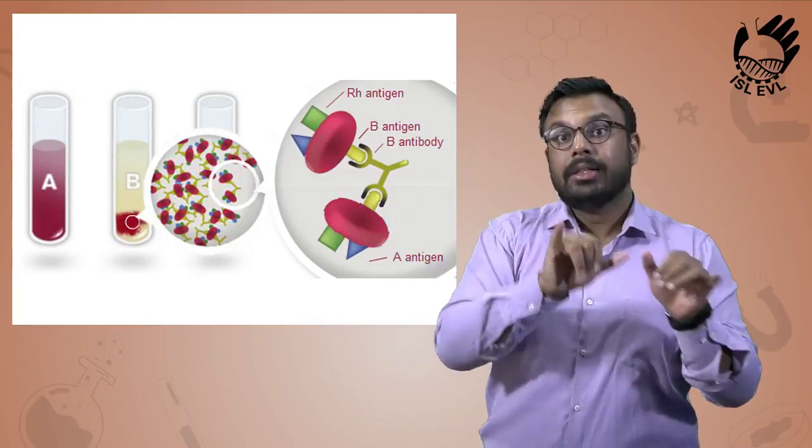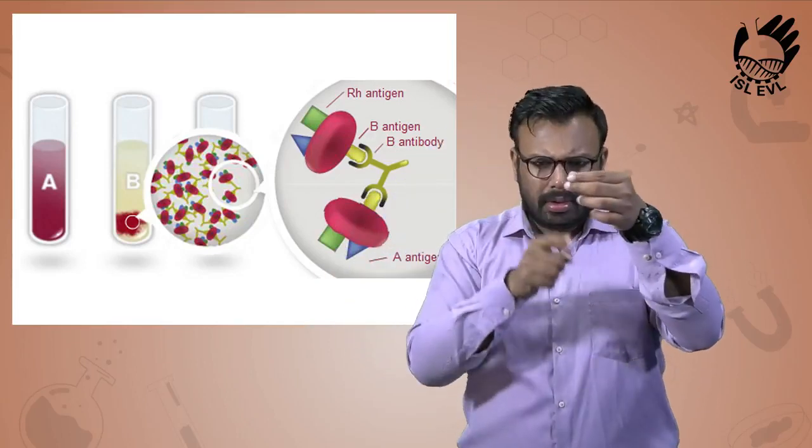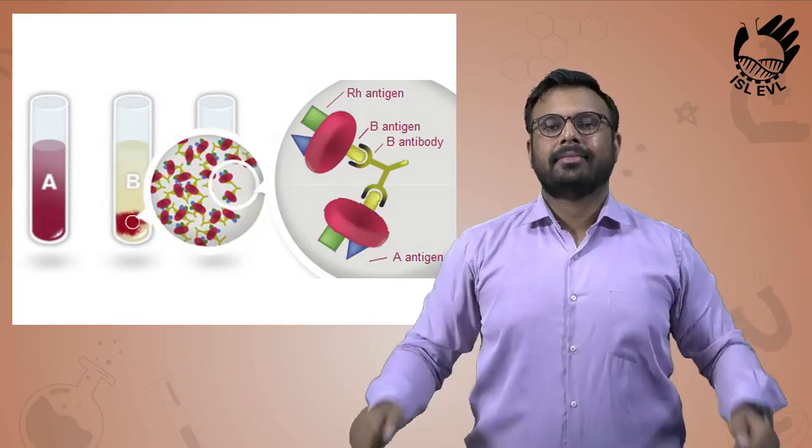Another example is if your blood cells stick together when mixed with antibodies against type B blood, you have type B blood.